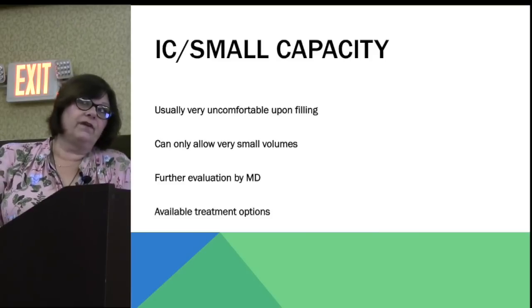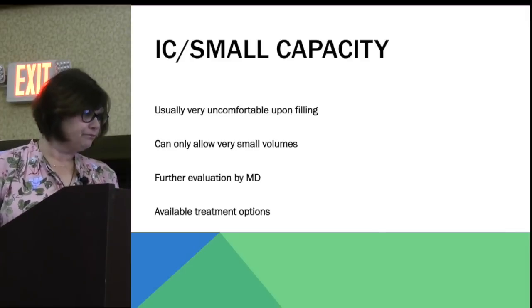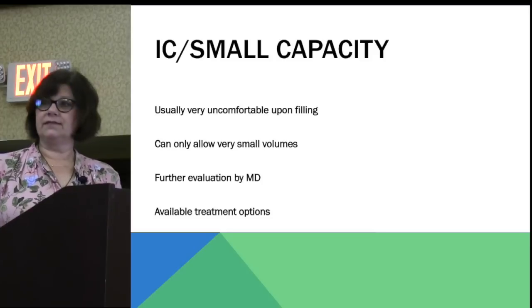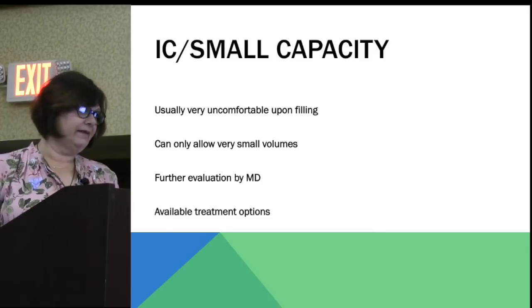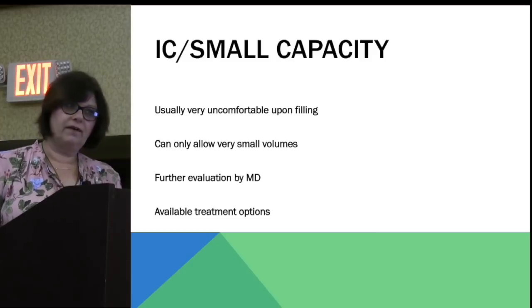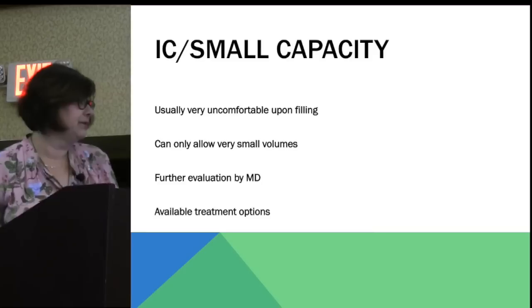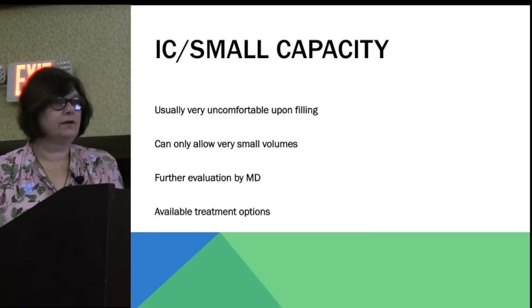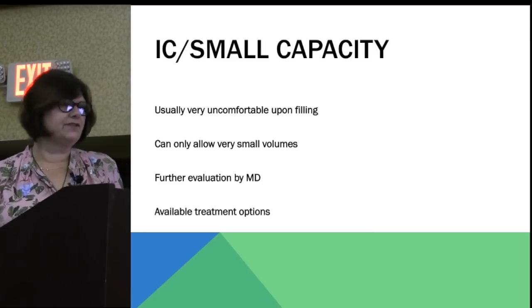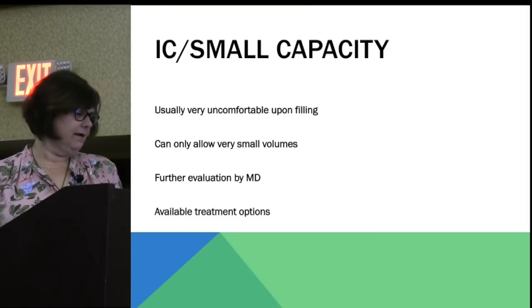Again, if you read the chart and you know this patient, you're going to do a slow infusion, and I've had people who literally have 10 mLs in and they're jumping off the table in pain. Do your best to talk them into trying to just go with it, but if you can't, you can't. You can't force them to do what they don't want to do. But again, very small volumes. You've got to refer them back to your provider and say, I can't get anything done here. We need to look at this in another way.